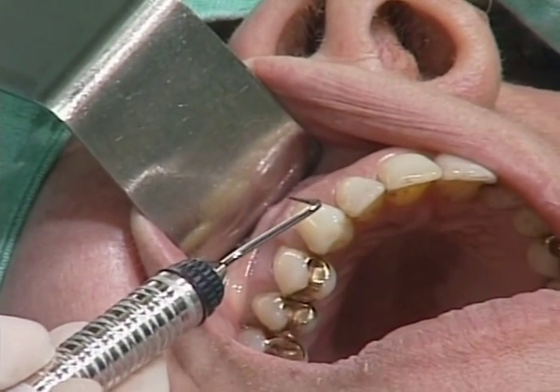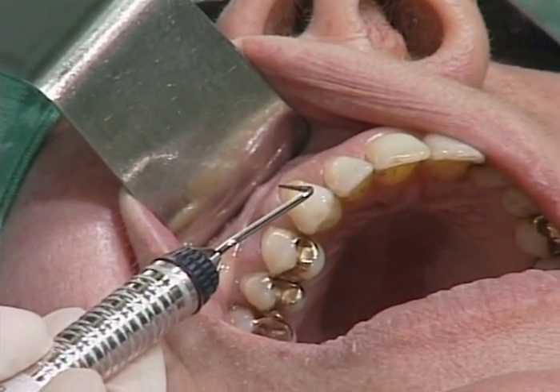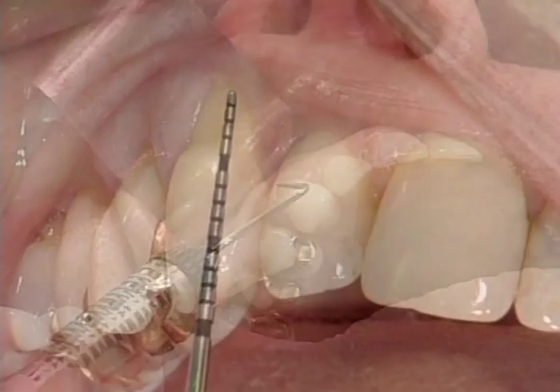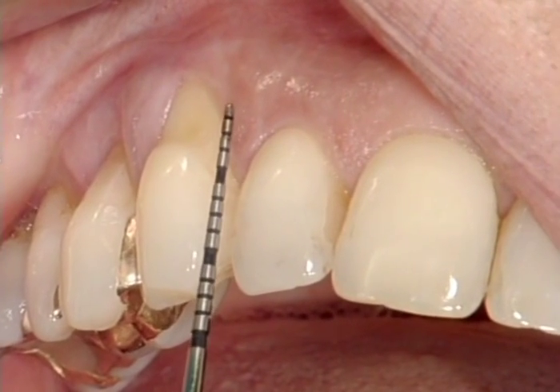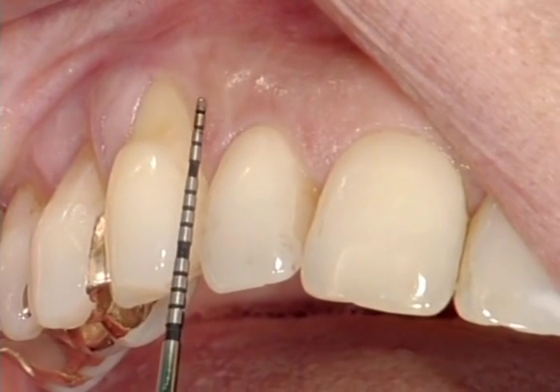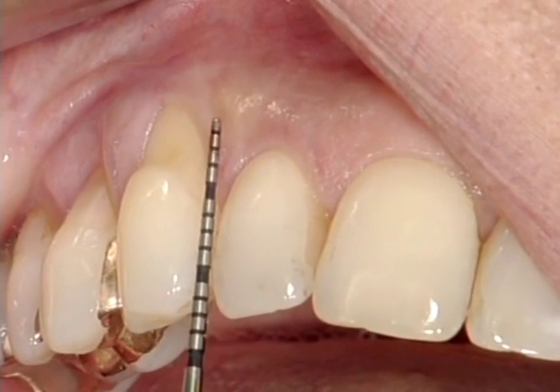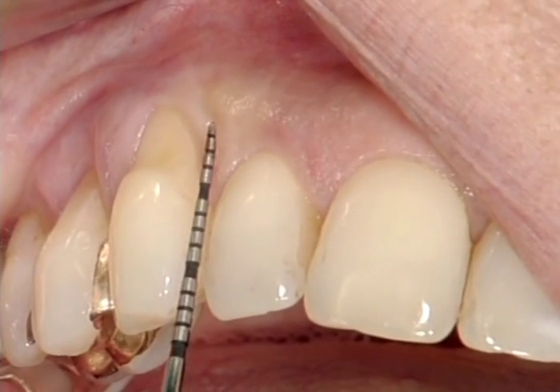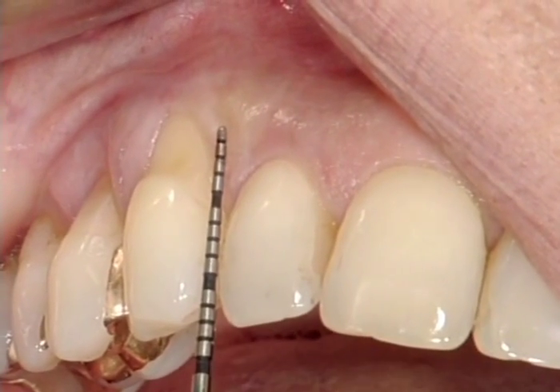This 55-year-old female shows a 5-millimeter soft tissue recession defect on tooth 1-3. The aim of the treatment is to achieve full defect coverage.